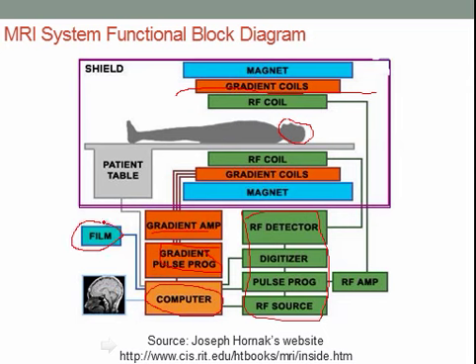Film, that's an old reference to when the MRI pictures were actually printed out on film, like an X-ray film. Now everything is digital. All images are now in DICOM format. So everything is in DICOM format. It's a standardized way of looking at images. It's not only for MRI; DICOM applies to all the other imaging modalities, X-ray, PET scans, and so on. Okay, so that's just a really quick look at the system block diagram.